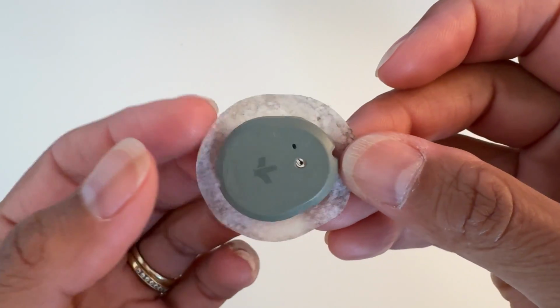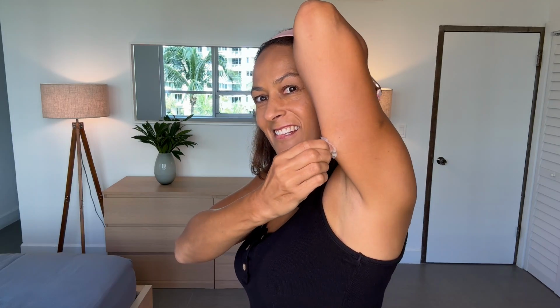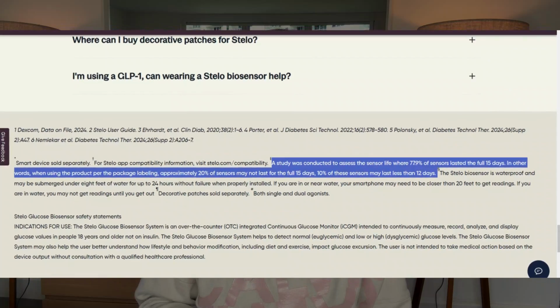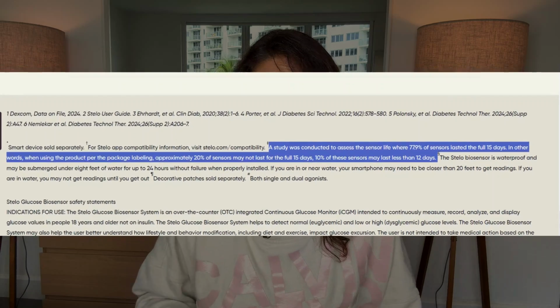The sensor lasts 15 days and 12 hours, and when it expires, you'll be notified in the Stelo app. And you can just peel off the sensor, kind of like a Band-Aid, and you can see it pulls out the sensor as well. According to the Dexcom website, 20% of sensors may not last for the full 15 days, and 10% of the sensors may last less than 12 days.